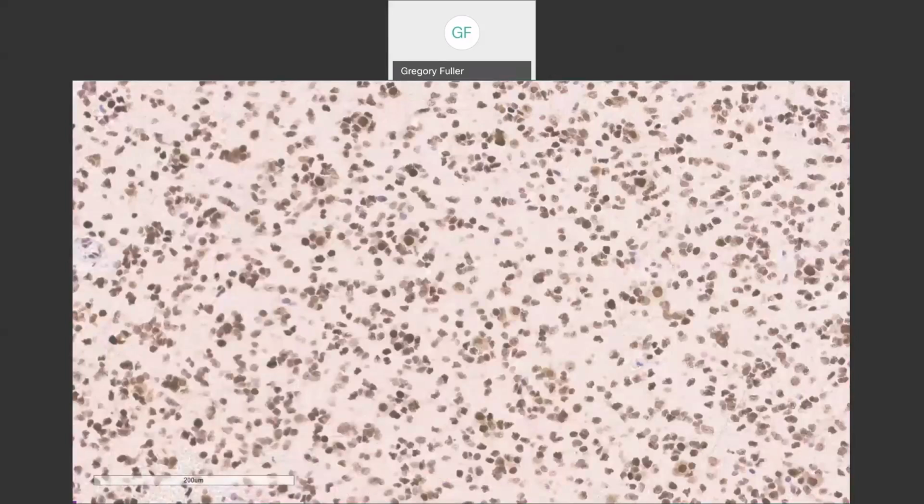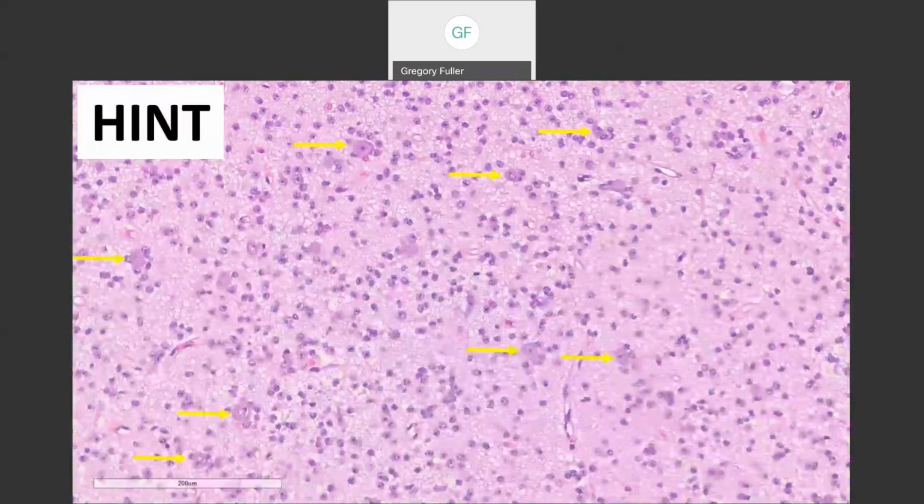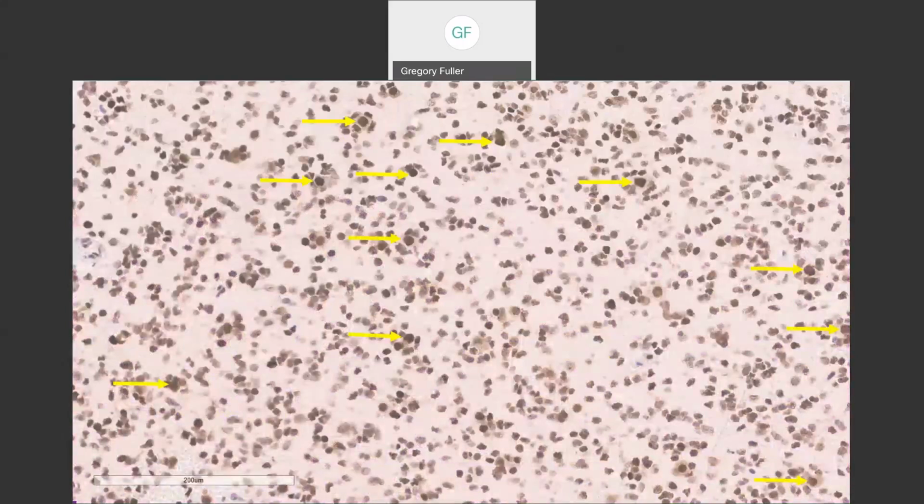Now let's look at our immunostain. Do you see how there's clustering around all those big guys? All right, what's labeled here are neurons. You recognize them because they're large. These are projection class neurons, central nucleolus, Nissl substance. These are big neurons, ganglion cells. Look at the big black nucleus in the center of the clusters. Everyone see the clusters? There is no doubt there's diffuse infiltration of the neuropil in between the neurons, but there is also a pattern of clusters.